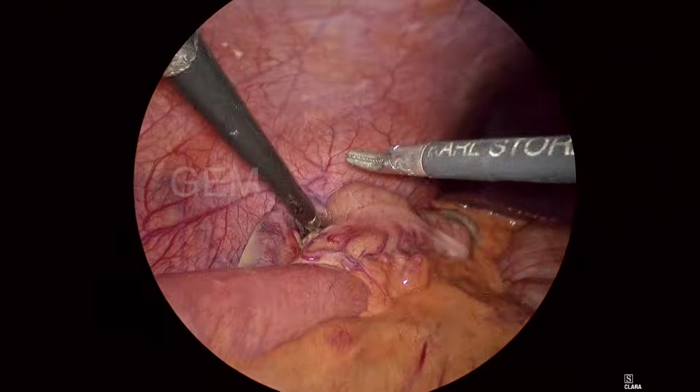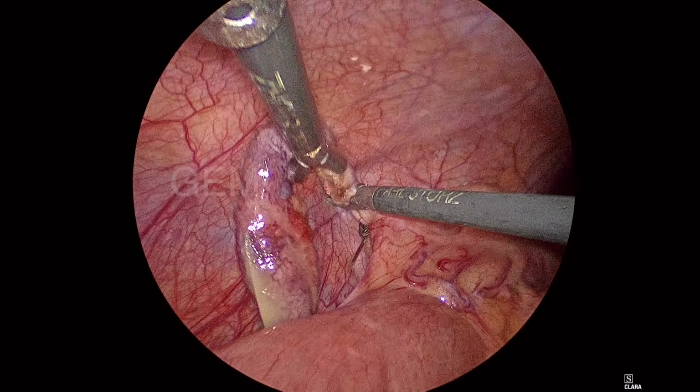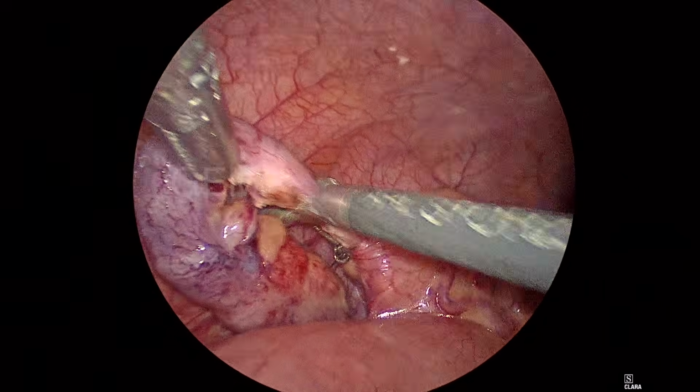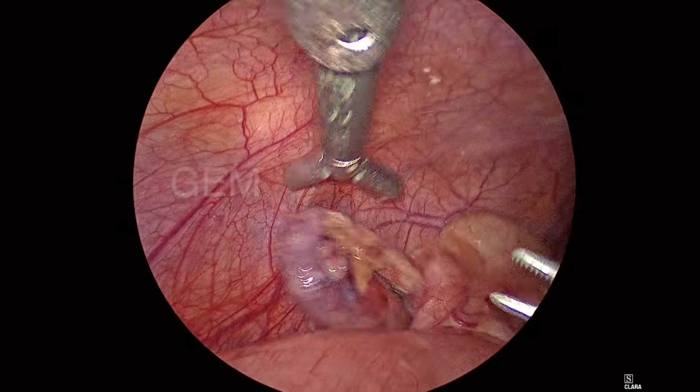Once you apply the loop, you can check whether it is applied correctly, or sometimes you put it a little bit above, close to the appendix, then the second loop will be at the level of base. So I'm milking it out again. You can see I'm holding only the fat covering the appendix, the mesoappendix, where I'm holding it.